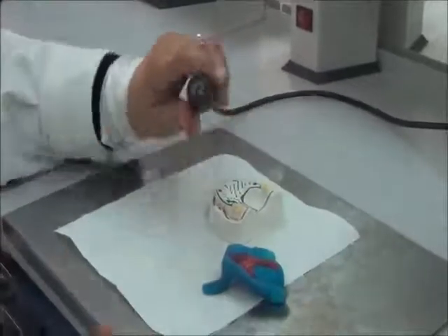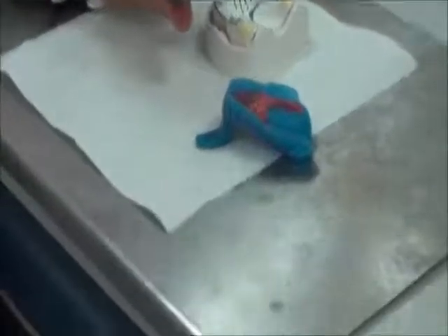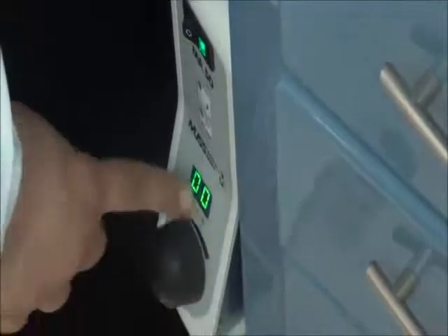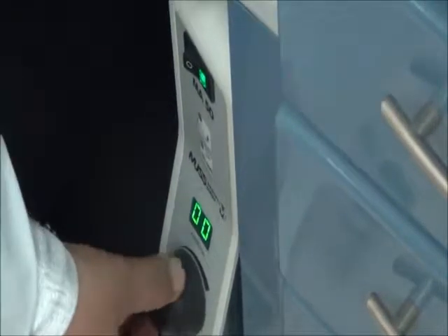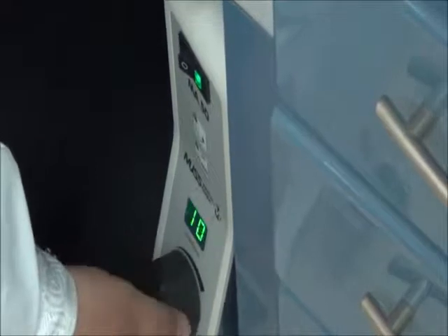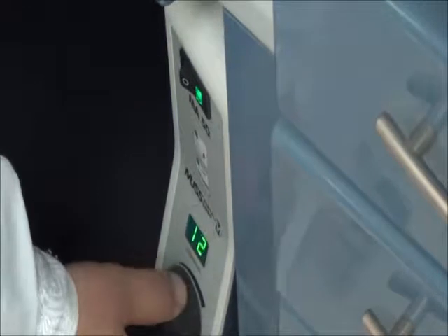We're going to use the handpiece control unit that you have on your chair. You can see here that this is the on and off button, and this is to control the speed. If I press to operate this, it will not work because it's on zero speed. If I raise the speed, the handpiece will be working faster. You can notice that from the sound of it.